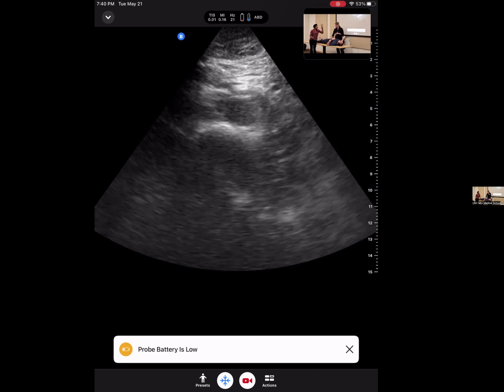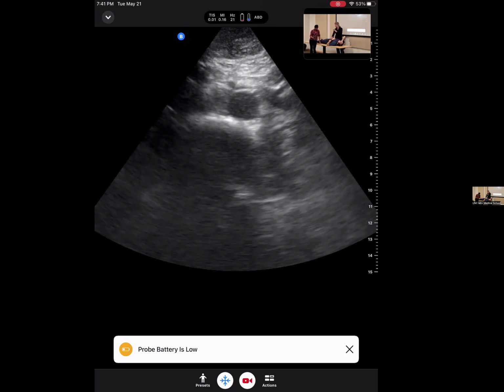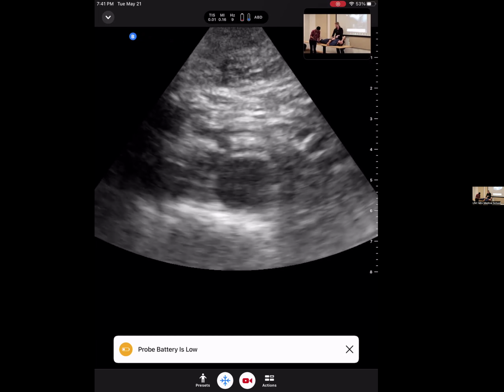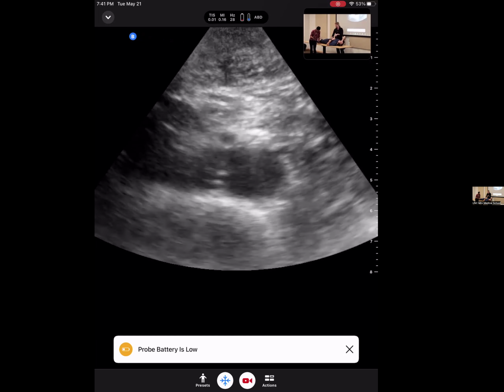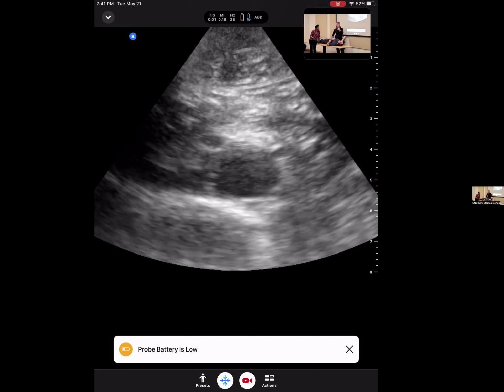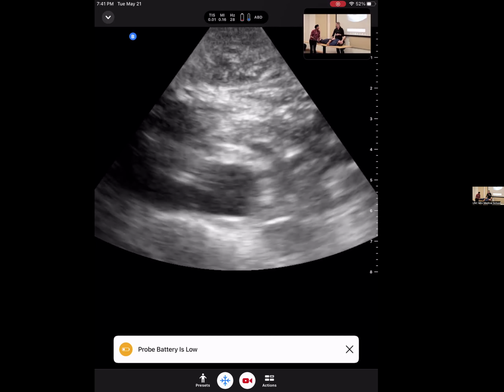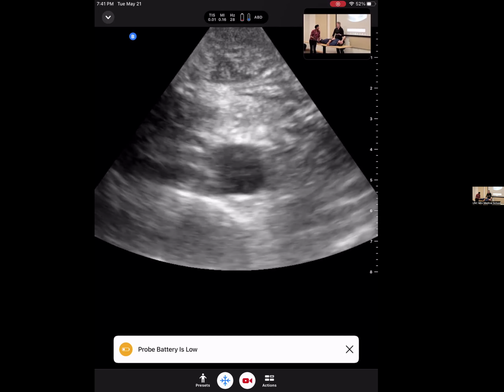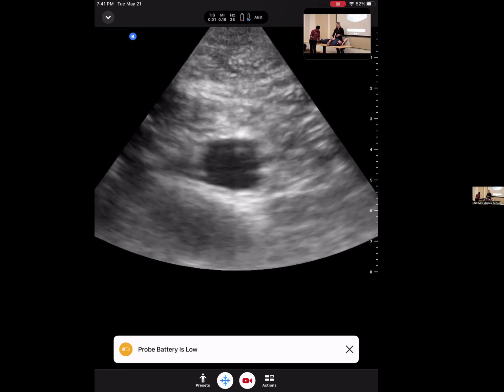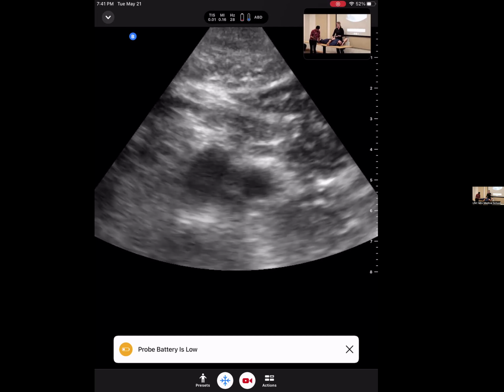See, there's the aorta. The aorta is the blood vessel that takes all the blood from the heart all the way down to the lower part of the body. So we can tell things like, is it too big? You might be at high risk for having an aneurysm, or have a history of thrombosis. So we can use this essentially as a screening, to keep an eye and make sure your aorta is not growing in size.